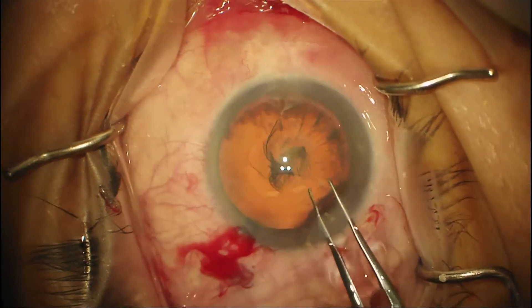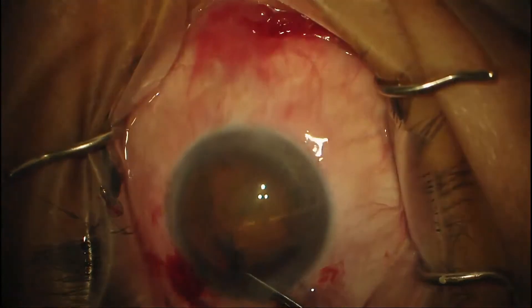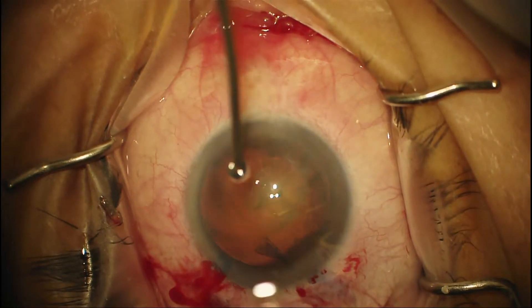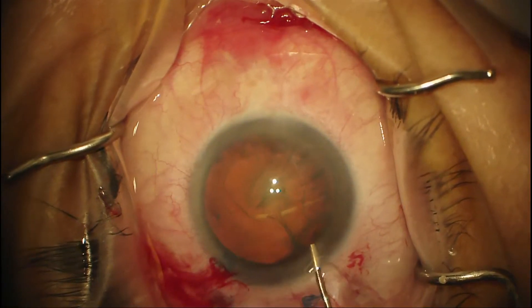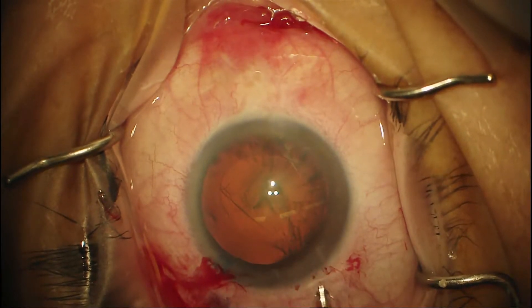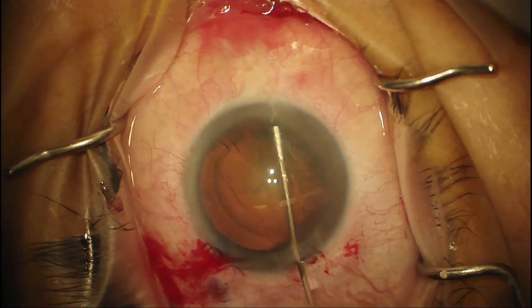We've made the rhexis — it's about 5 to 6mm, a little bit eccentric perhaps, but still good. Now we're putting some BSS in the anterior chamber to bring out the rest of the anterior capsule, and we're going to do hydrodissection. It's good to see a fluid wave. After you inject some fluid you always have to blot and push down on the nucleus so that any fluid is released so you don't blow out the capsule.